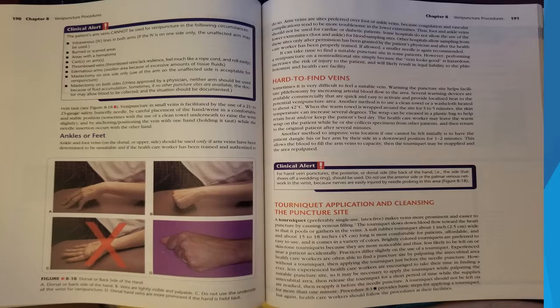Venipuncture in small veins is facilitated by the use of a 21 to 23 gauge safety butterfly needle. By careful placement of the hand or wrist in a comfortable and stable position, sometimes with the use of a clean towel underneath to raise the wrist slightly, and by anchoring, position the vein with one hand, holding it taut while the needle insertion occurs with the other hand.